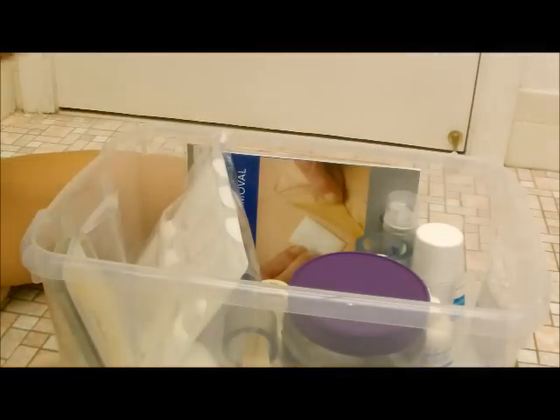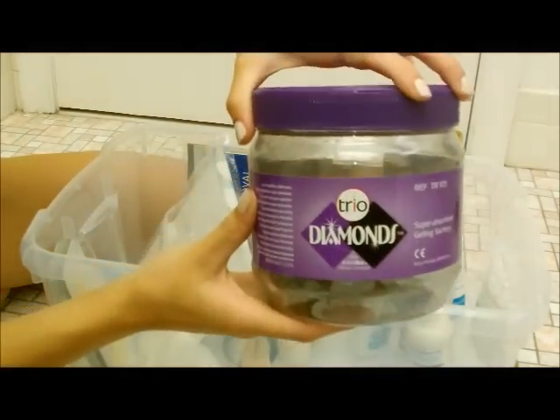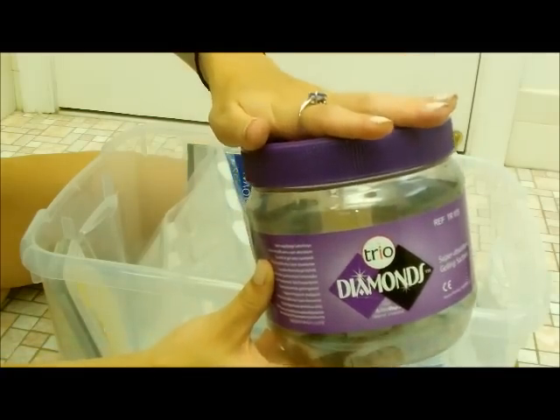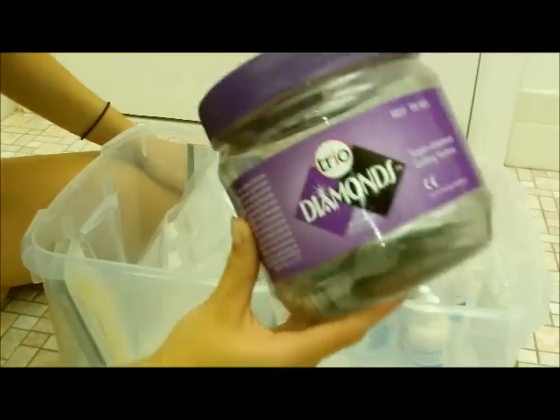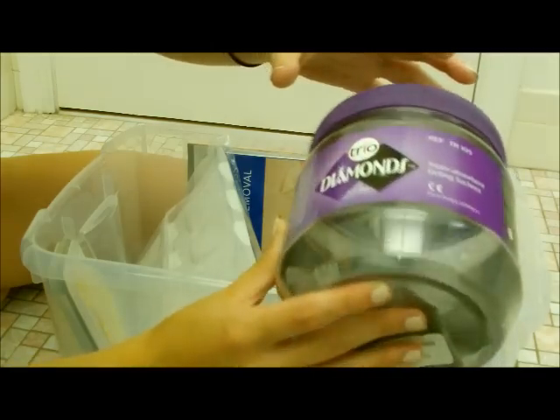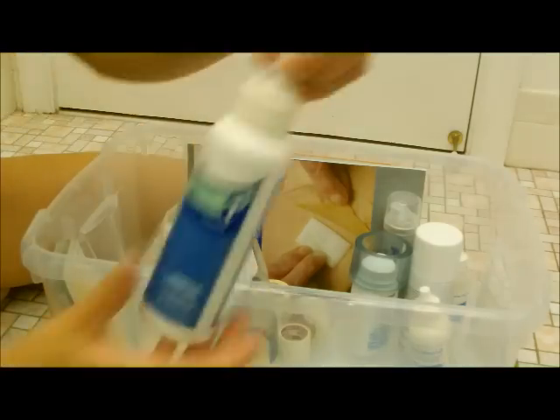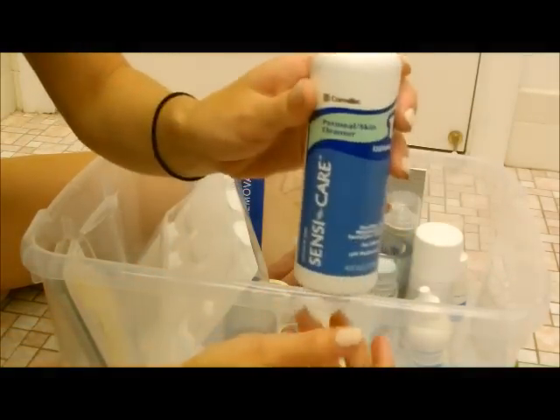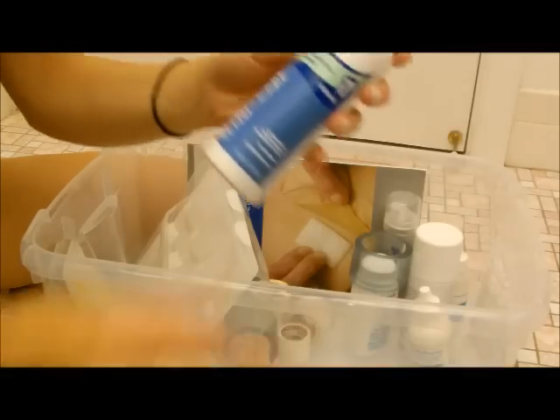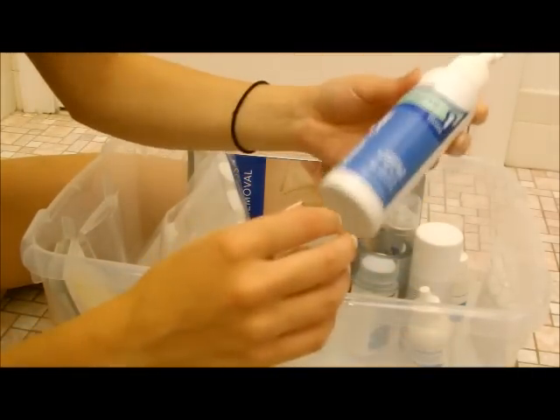And other than my cleanser, I have the diamonds too. But I believe these do not come as SensiCare packaging. These are the gelling sachets that gel up your contents so it's not as liquidy. They also deodorize it, which is great. And the other SensiCare thing, the last thing I have, I've had this for forever. It was funny, when I got home, I realized it was the same brand as the wipes that I use. But this is just a cleanser. I don't use it too often. Pretty sure they gave it to me in the hospital.